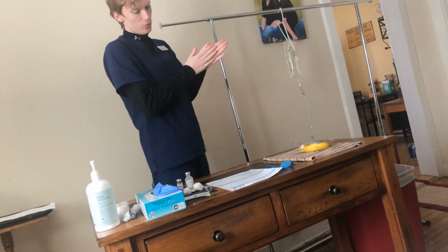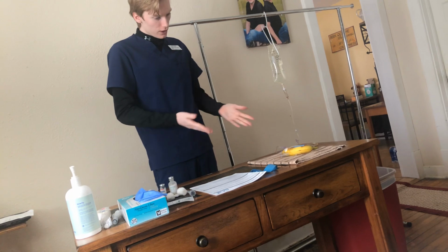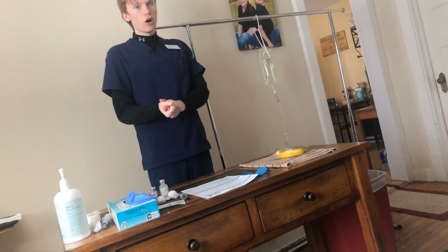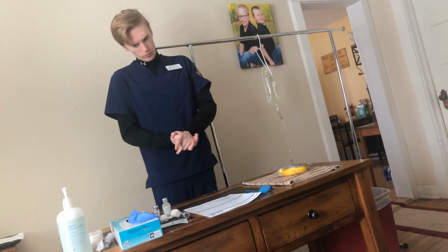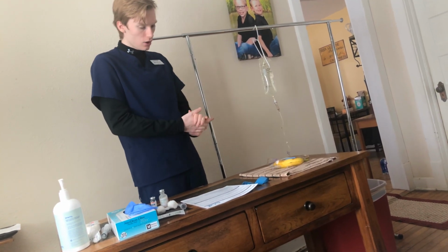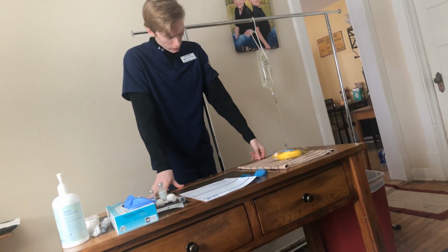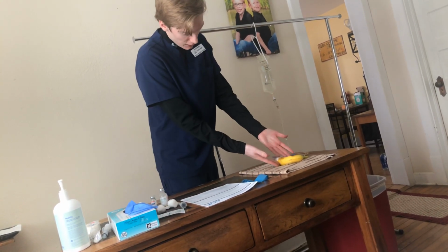Enter the patient's room. Hello, I'll identify myself. My name is Dante Downing. I'll be your nurse for tonight. How are you doing? Good. Are you having any problems with your IV? Any pain, redness, swelling, things like that? No, perfect. Again, I'm just going to assess the site anyway.